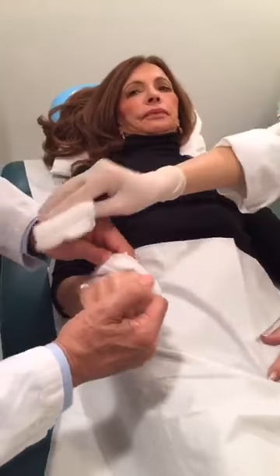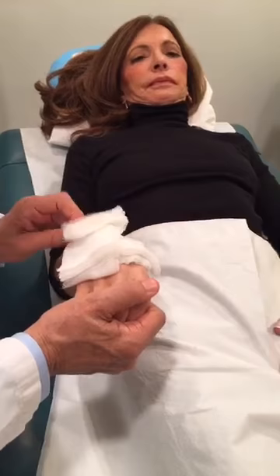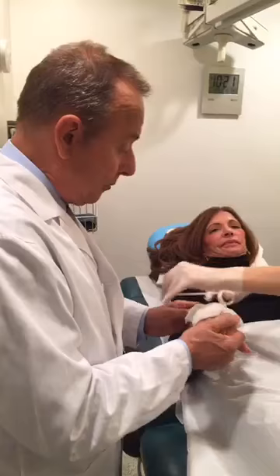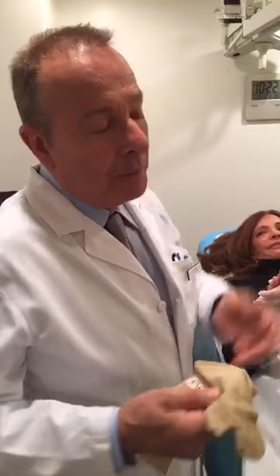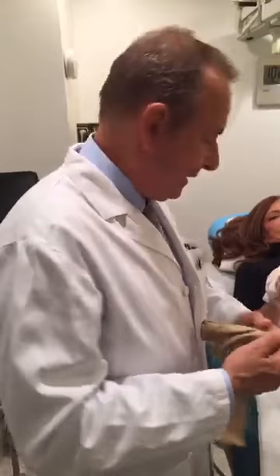We put the anti-inflammatory cream. Now we put the glove, she'll rest a few minutes, and that will be it for today. We'll see her in two weeks; she will take the glove off tomorrow morning. No restrictions. Are there any side effects for this procedure? Usually not — maybe a little black and blue. It will work in one treatment or two or three, maybe even four. But the complications are minimal, non-existent.